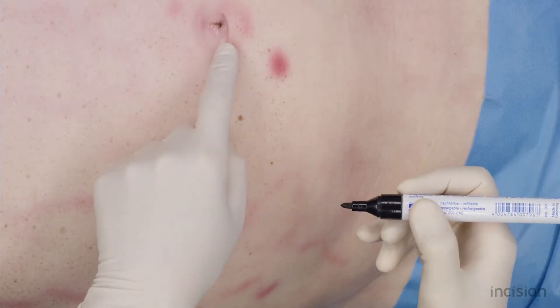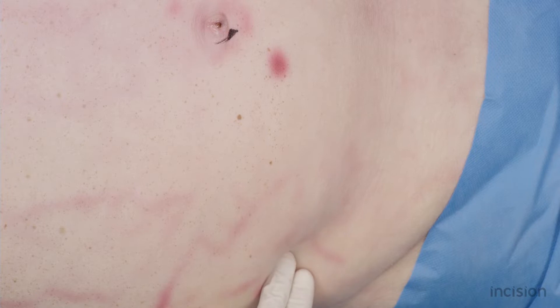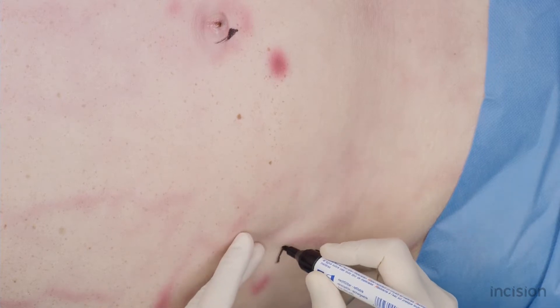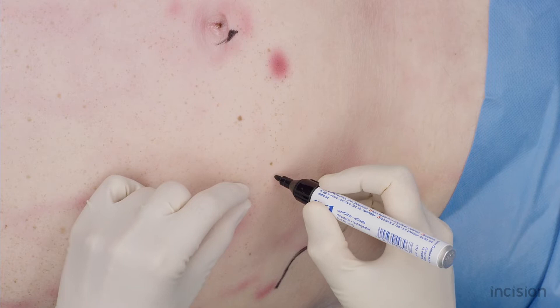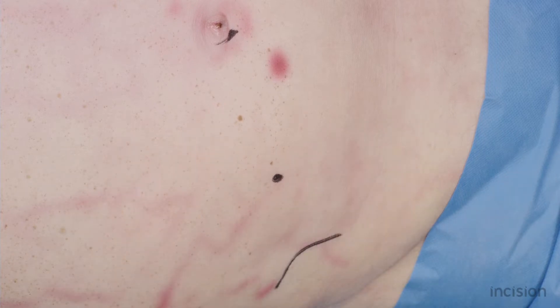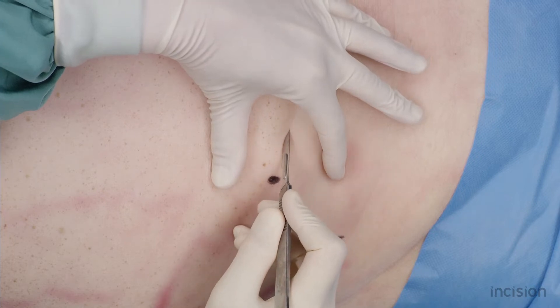The anatomical landmarks used in this procedure are the umbilicus and the anterior superior iliac spine. The skin incision is made obliquely in the Langer's skin lines at McBurney's point, two-thirds of the way from the umbilicus to the anterior superior iliac spine. The incision is approximately 5 cm long.